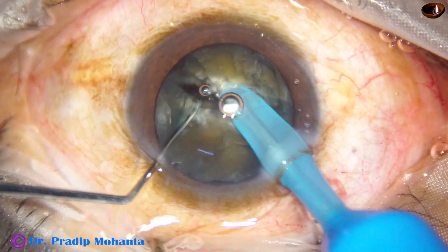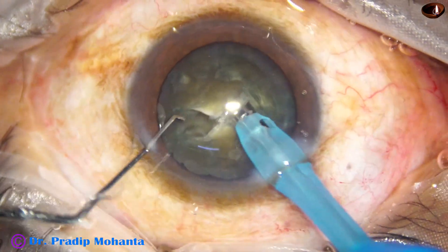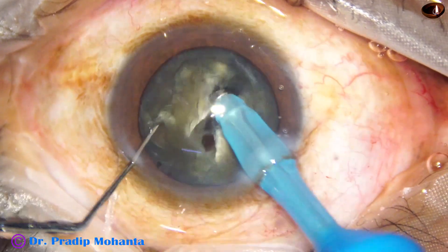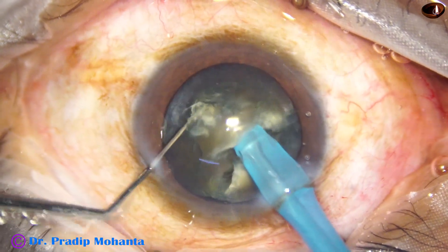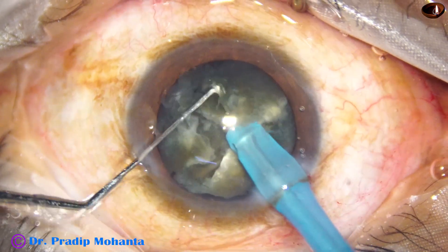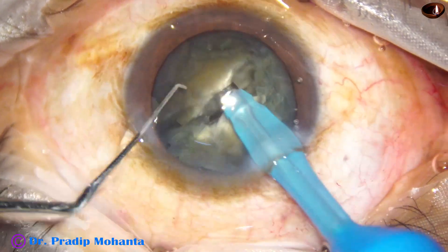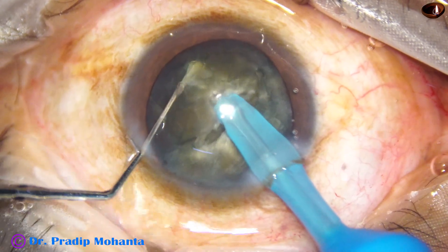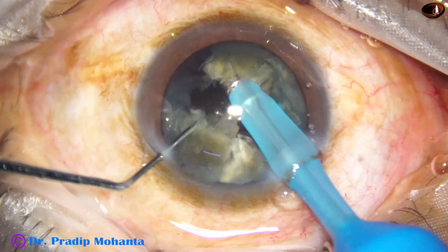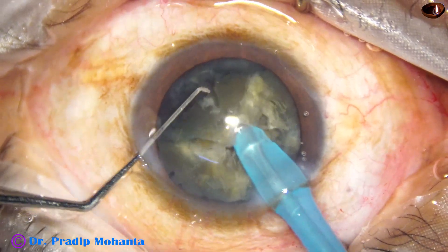We have got a very nice crack. Coming to the other side, one or two sculpts are done. Holding one side, the nucleus has been divided into two heminuclei. This heminucleus is subdivided into two fragments. We come to the other heminucleus and divide it also into two fragments, so we have got four fragments out of this hard nucleus.